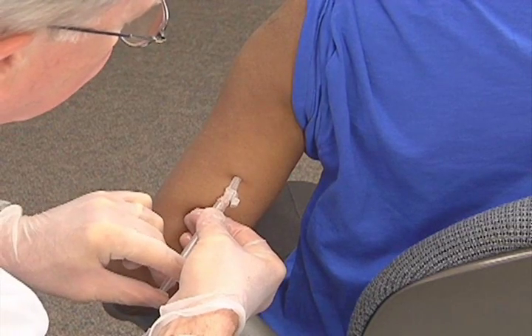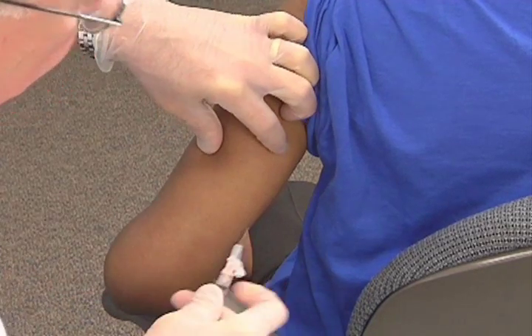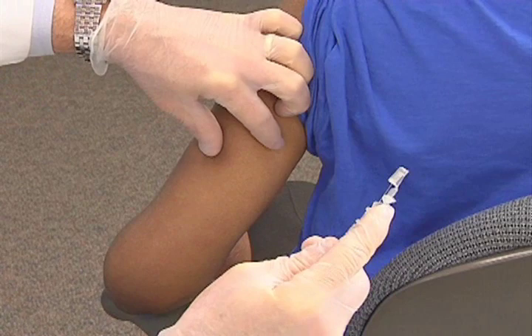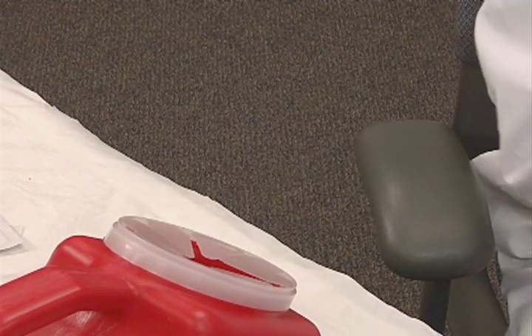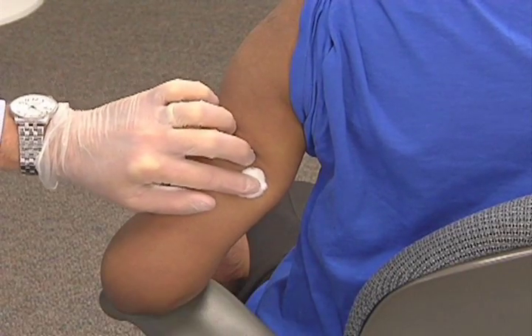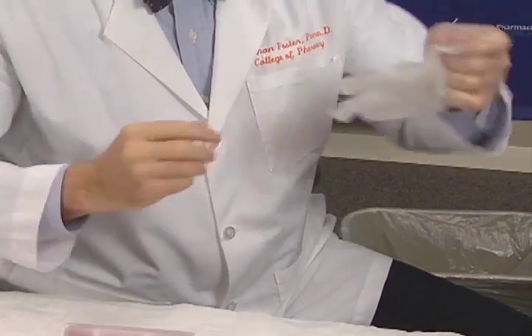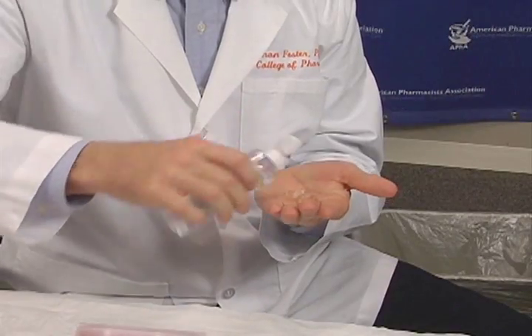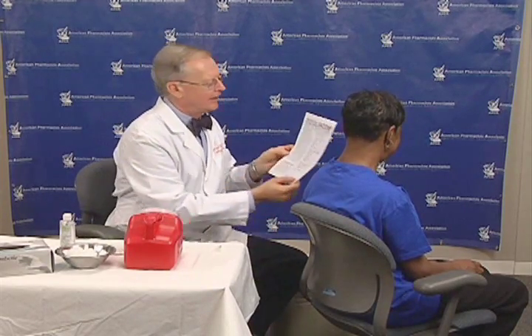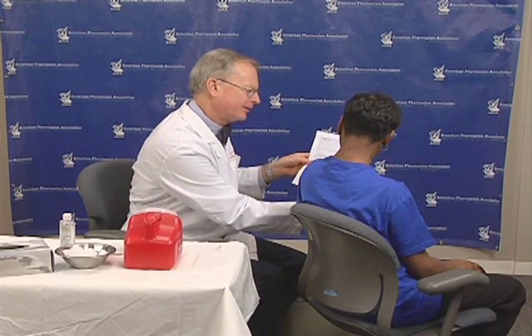Maintain contact with the patient at all times. While supporting the patient and the syringe, depress the plunger in a smooth and coordinated manner, then quickly withdraw the needle. Immediately activate the safety device and dispose of the syringe and needle in a sharps container. Press the cotton or gauze over the injection site and secure it using the adhesive bandage. Remove your gloves and wash your hands. Clean your workspace, provide post-injection counseling and follow-up instructions, and document the injection while maintaining compliance with all legal requirements.